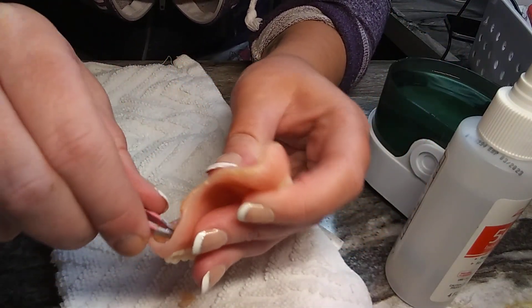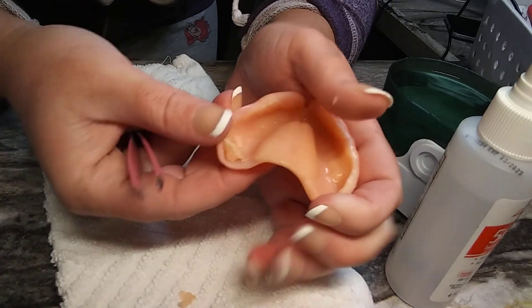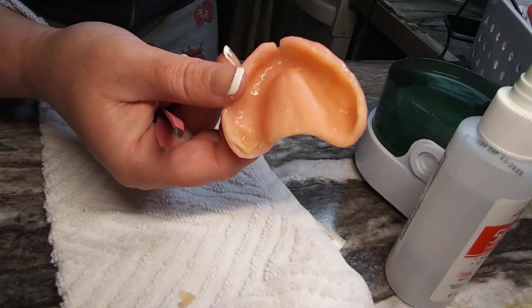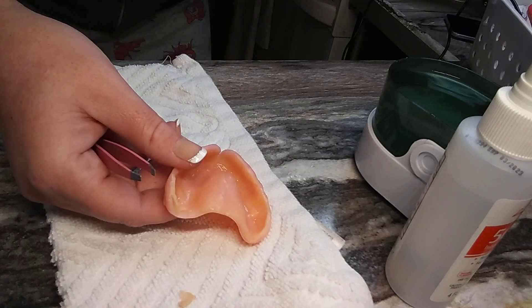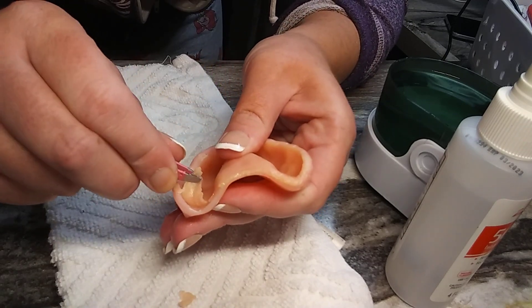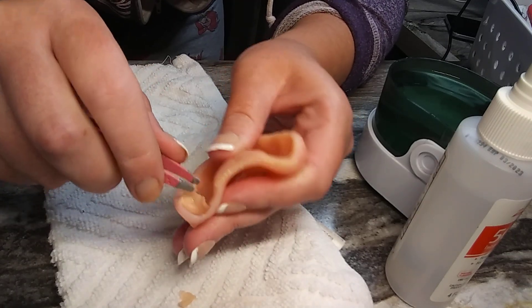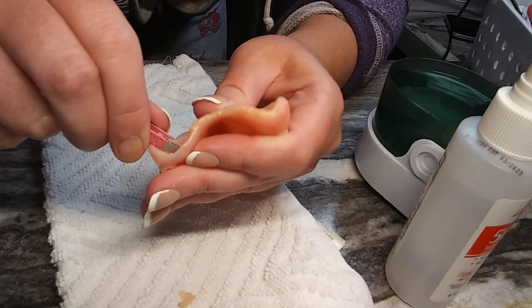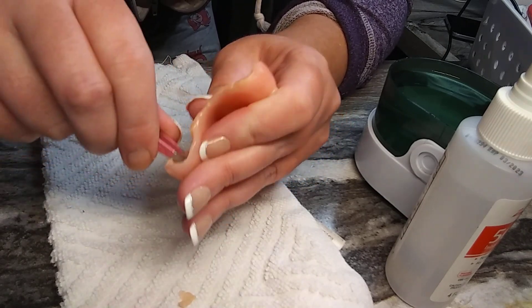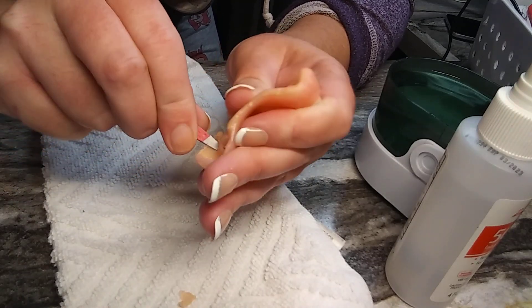I'm probably going to soak it a little more and get more loose stuff off, but I just wanted to give you guys a heads up on how to do this. See? Look at that lift up — using tweezers is the best because you can pinch-pull, pinch-pull. And it's like putty. I told you guys the palette is way harder, so working at the edges first is way easier. Be very careful.